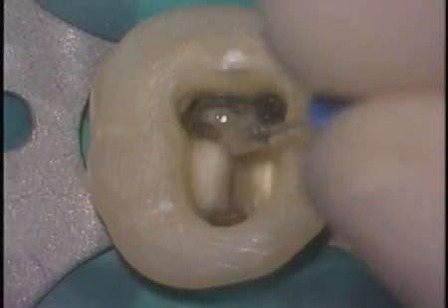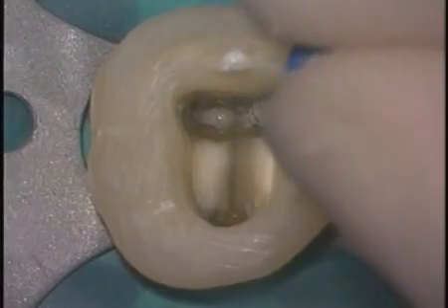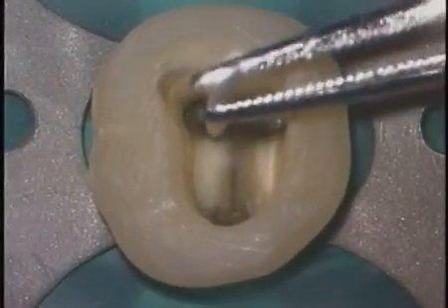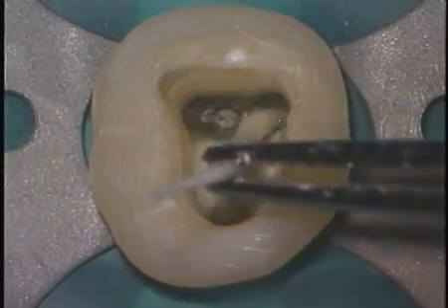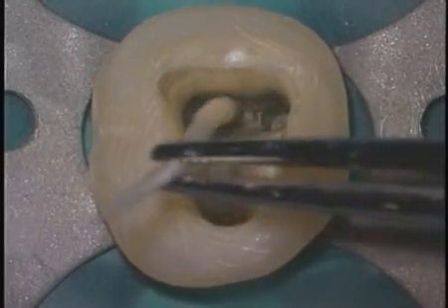I like to use a wet cotton pellet attached to a barb brooch to clean up the coronal aspects of the systems. This also tends to scrape all the residual material off the walls. The butt end of a paper point can wick the surplus moisture, and now you're getting a good look at the MTA deep.